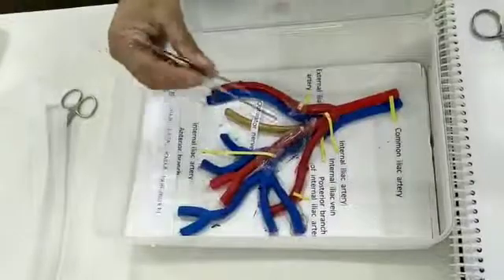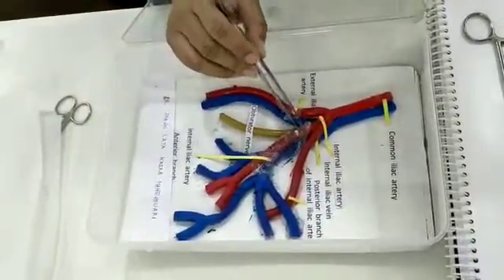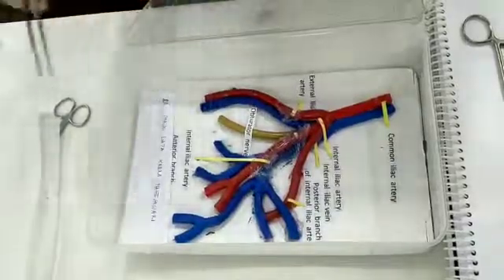After recognition, I mark the point where internal iliac ligation is to be done.